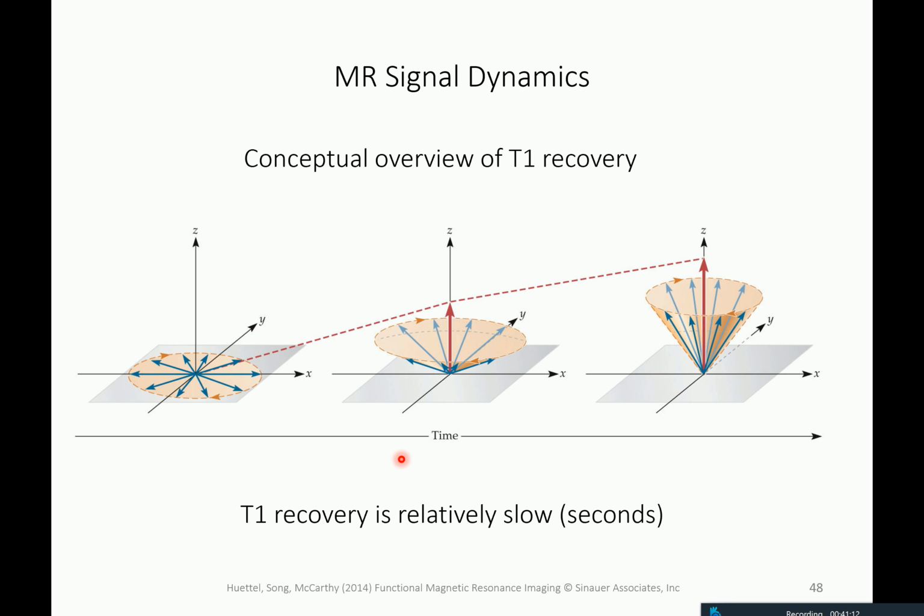This takes some time after things were tipped into the transverse plane, and is governed by the time constant T1.